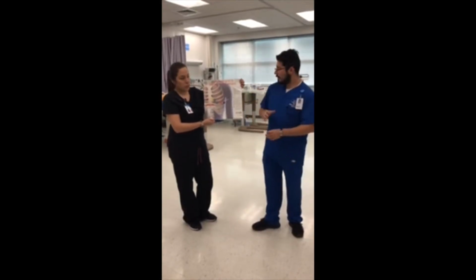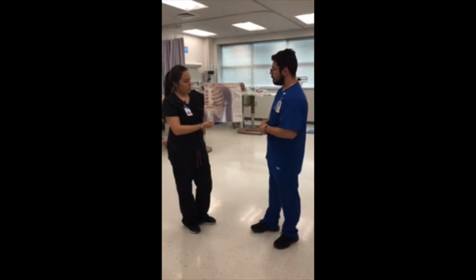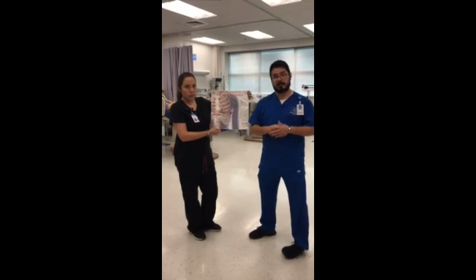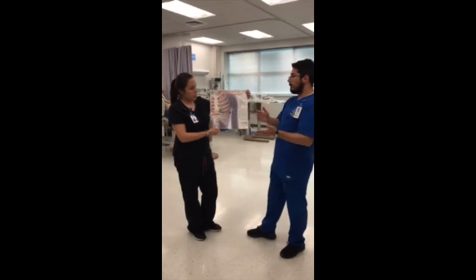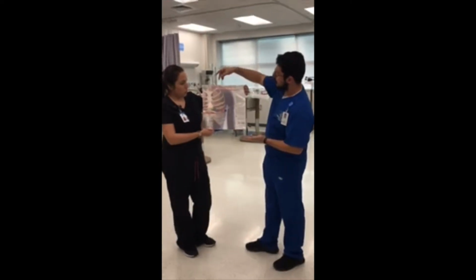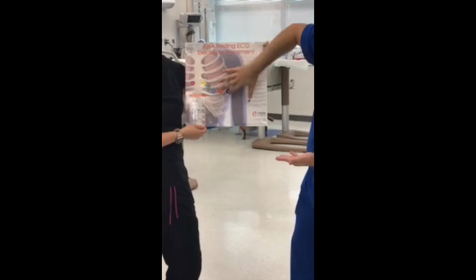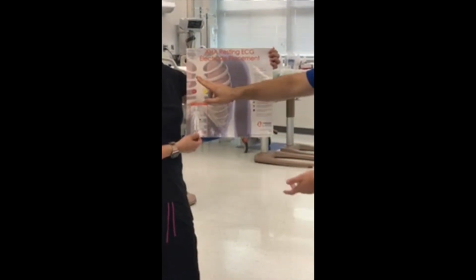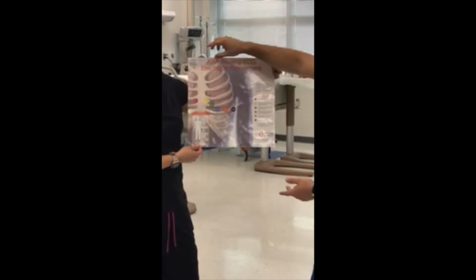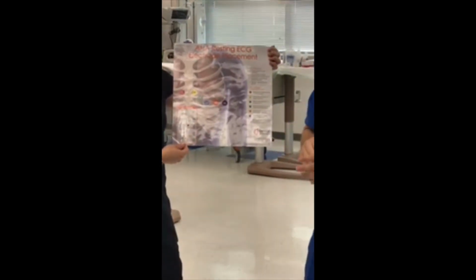Hi, okay, so in this portion we're going to be reviewing the anatomy of the intercostal spaces and of the rib cage in which the leads are going to go. So if we move over to our poster here, we see, according to the American Heart Association, we have your ribs, your lungs, and your heart here in the middle behind the sternum. So when we go down to V1, V2, it's important to understand that there are 10 on a normal ECG.